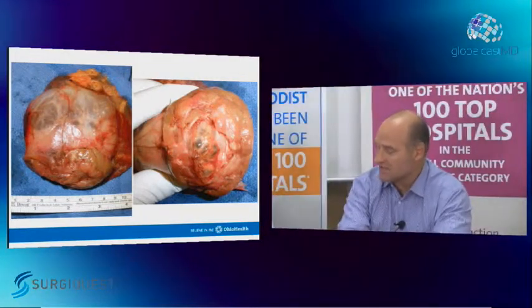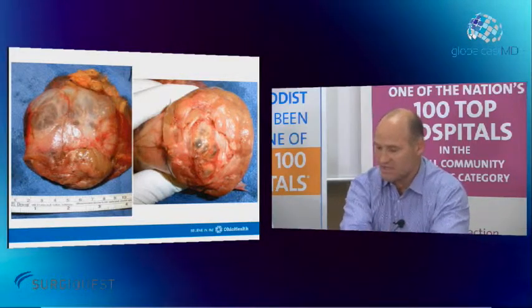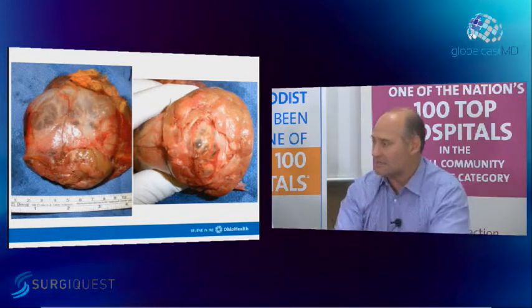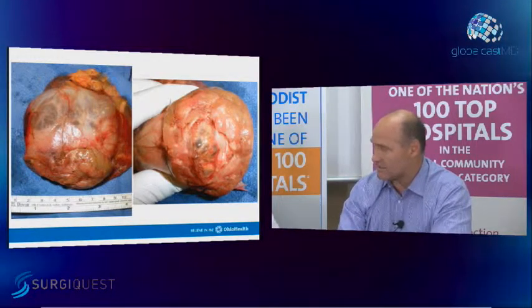left it, didn't even touch the cyst, and actually did a heminephrectomy after I got vascular control to everything that was going to the cyst. Then I just moved the lower pole away from the upper pole and left it until I did all the closure, and at the end I came and got the cyst out, and it worked quite well. That way all the fat around the cyst keeps you from popping it. That's right, and you're not handling it.